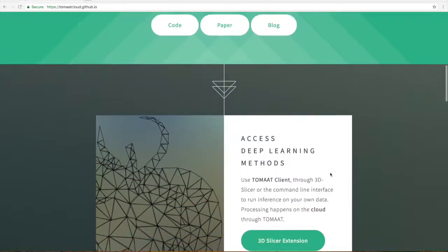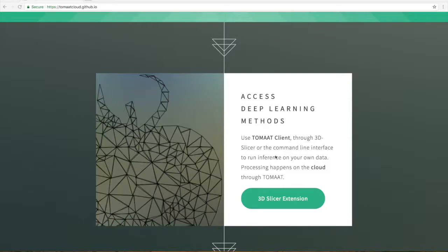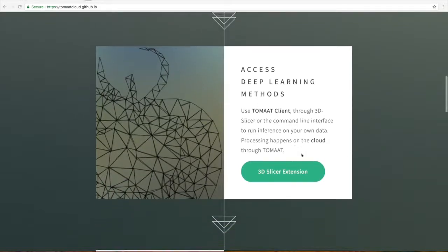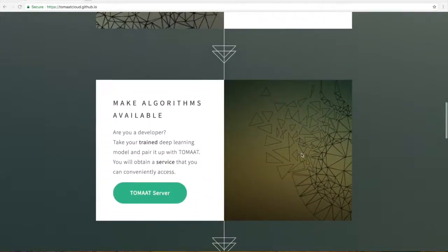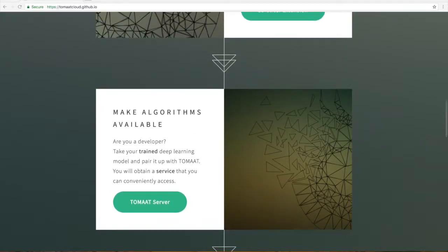One part is the client, which allows users to access deep learning methods. This client is realized through an extension of 3D Slicer and is what we will see today in this tutorial. It has a server, which is a package important for developers who want to make their algorithms available to the general public.